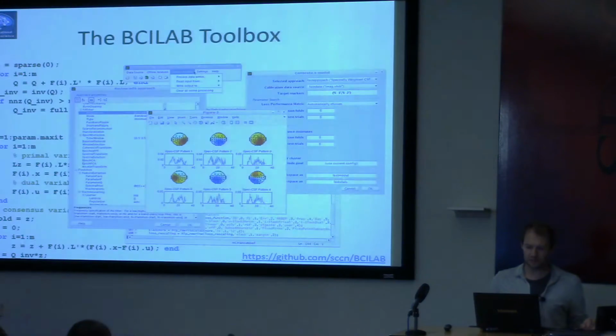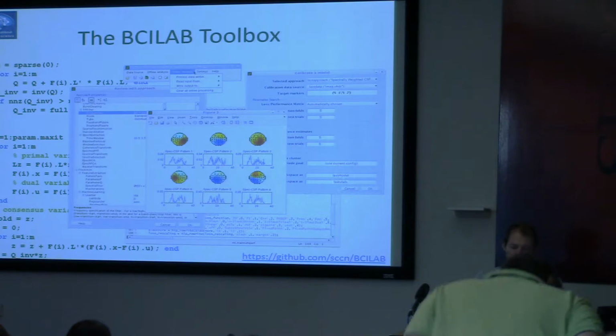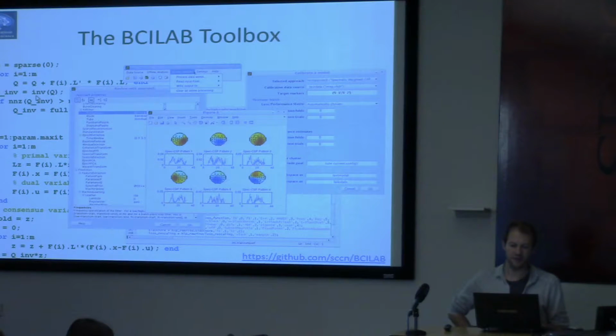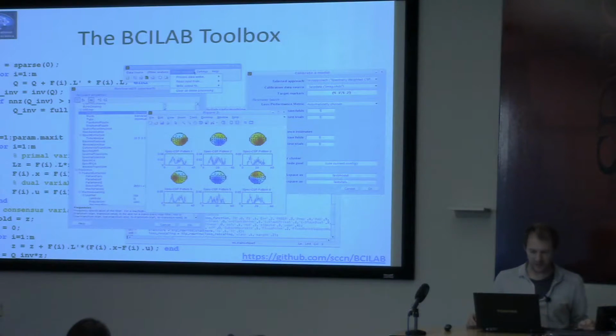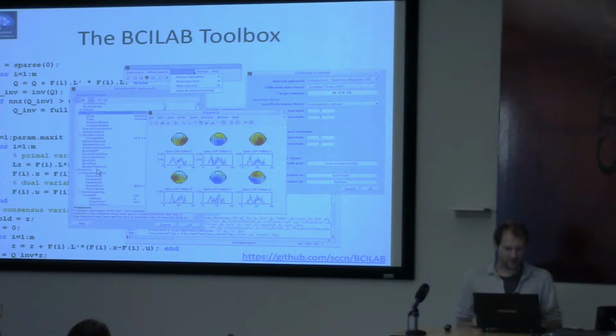So these are some of the uses, and the toolbox that we build is a MATLAB toolbox. It's very much in the EEGLAB spirit. It has a nice user interface on top, and underneath there are a lot of methods in it. And in fact, the user community is sort of divided into two camps. One is method developers who develop and test new methods, new algorithms, like you see a whole list of them in this little grid here.